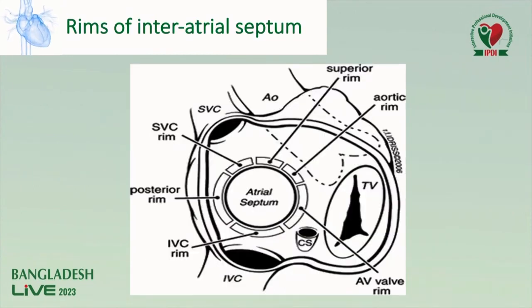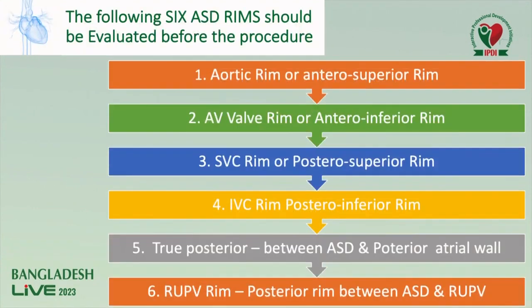These are the rims of the interatrial septum: aortic rim, AV valve rim, IVC rim, posterior rim, SVC rim, and superior rim. There are 6 rims in atrial septal defect.